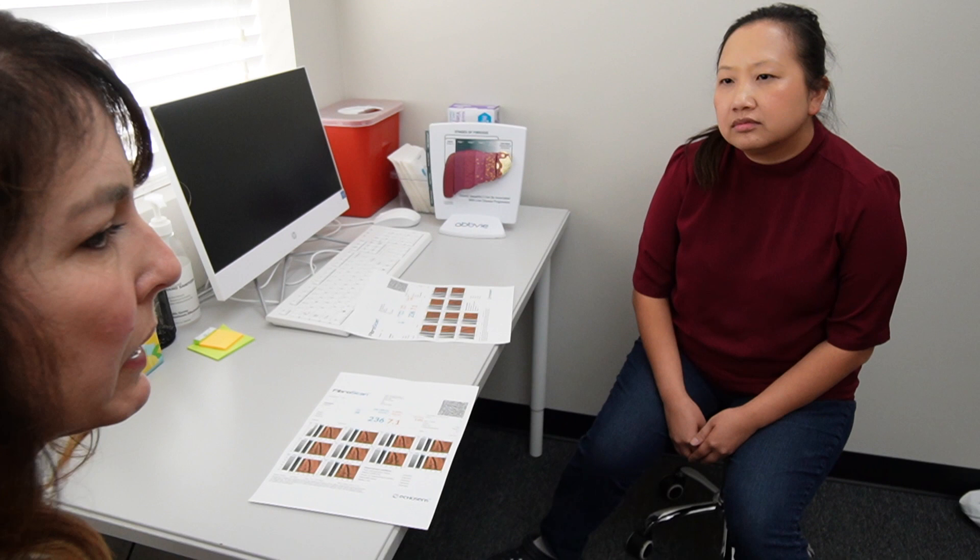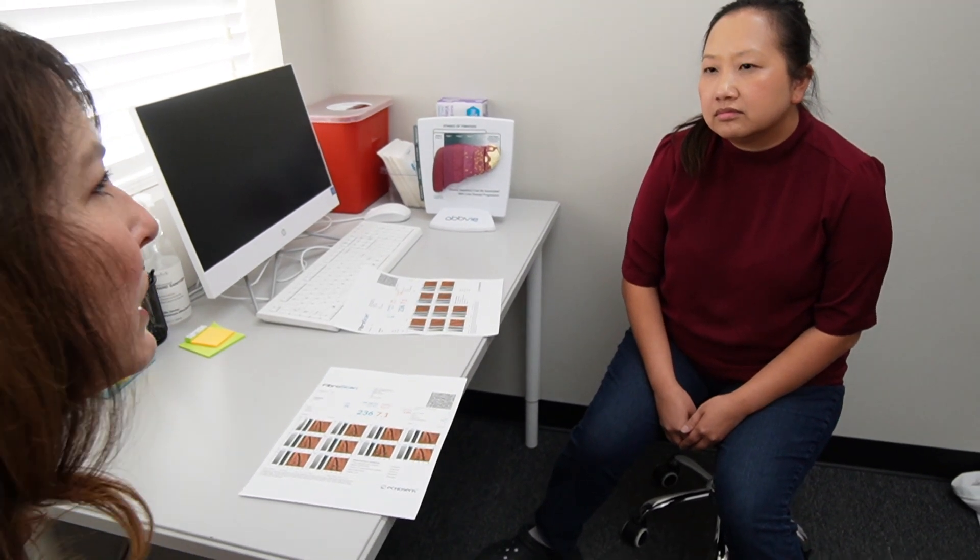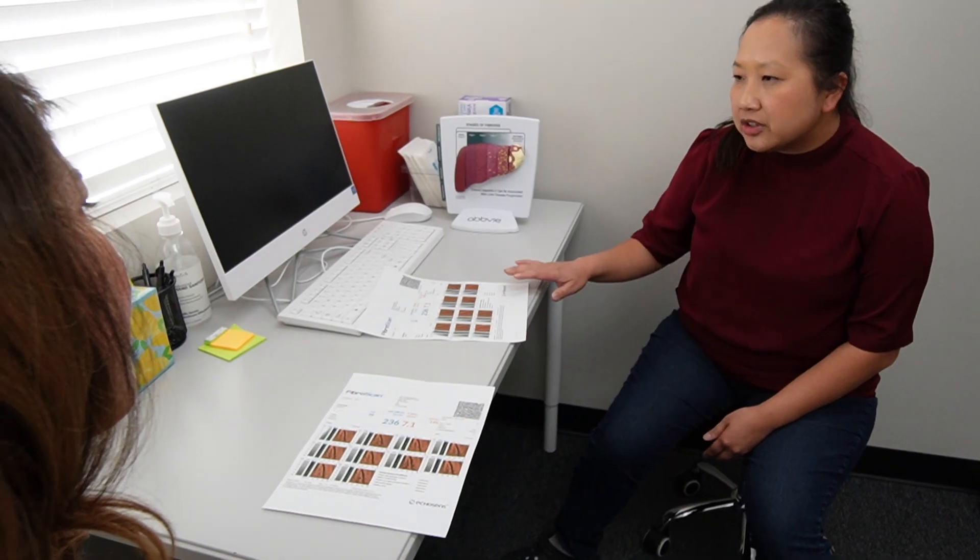A minimal fatty content number is about 230 to 260 and that's essentially normal or very mild fatty infiltration in the liver. You expect some amount of fat in the liver because all organs have some fat and that's normal. But you want to have your number essentially be in the 200s.